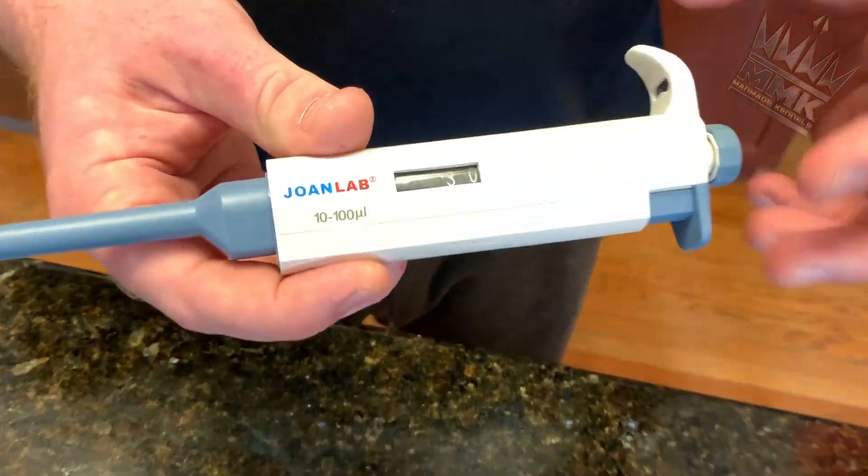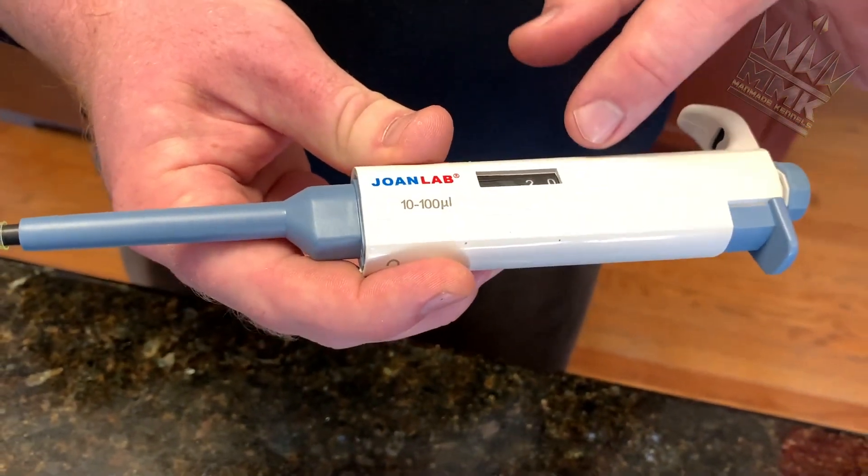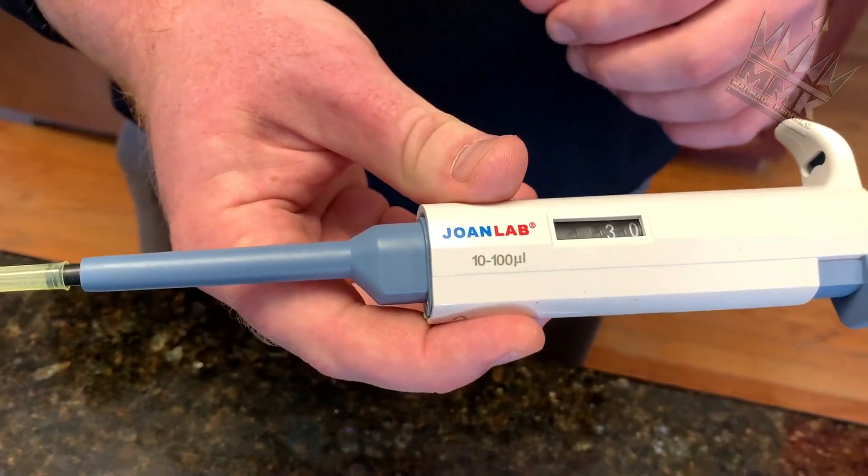I'm going to teach you guys how to do an at-home progesterone test for those of you who like to do everything at home like me. So I'm going to walk you through everything that you're going to need. This is your pipette — we're going to change the amount of ULs we're going to be using, but I'll walk you through that as we do it. This is our progesterone test strip.